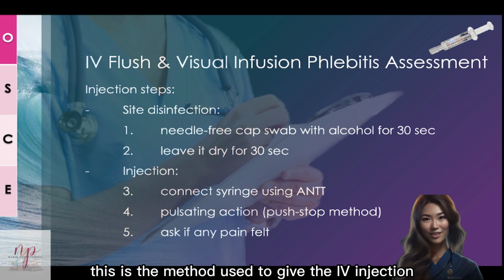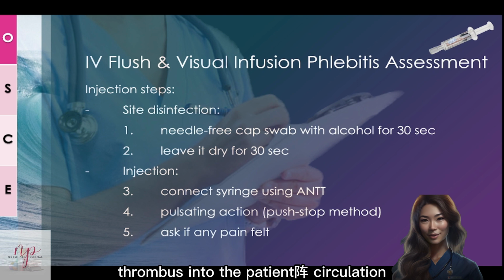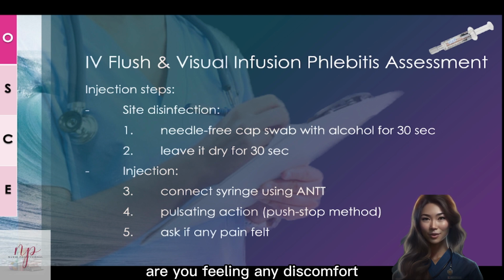This is the method used to give the IV injection, so that you won't flush something like a blood clot or some thrombus into the patient's circulation. So when you are doing this push and stop method, make sure at the same time you ask your patients, are you feeling any discomfort? Are you feeling any pain? Okay? So this is point number 5. Ask if any pain is felt.